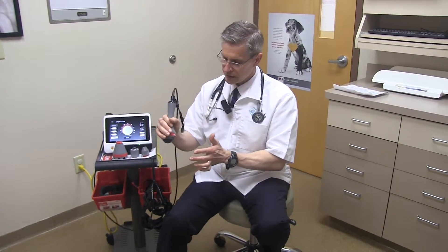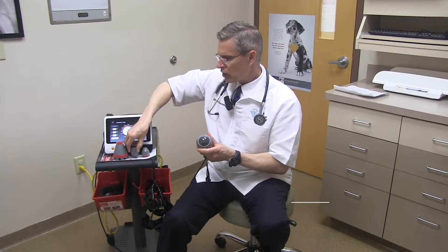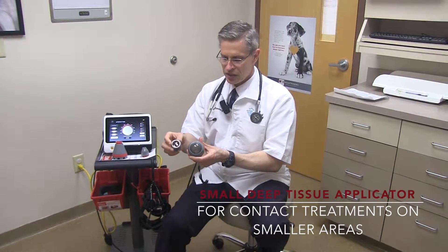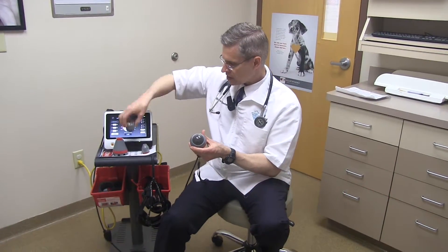There's been debate on whether animals should be shaved or not. We don't shave our animals because the owners really wouldn't like that, so I feel really good that this head gets down into there. For a smaller area, we simply have a smaller contact head that we use for those little bit more delicate areas.